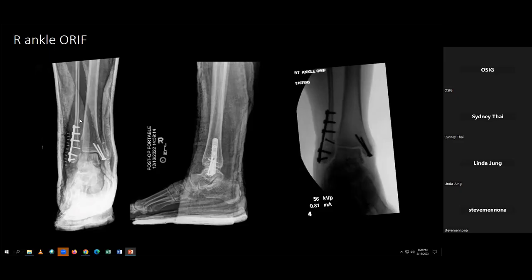So cortical bone, or the bone on the outside, is much denser, whereas bone in the metaphysis is spongier and softer. So they actually designed specific screws that bite into certain types of bone better. To get that distal bone fixation, they make these screws with bigger pitches. And the ones that are proximal also go bicortical, so you're crossing both cortices. That's giving you stronger, more rigid fixation. The one distally, you could go bicortical, but I think a lot of the surgeons here like to go unicortical to avoid going into the joint line. Because if you can imagine a screw going into that joint line, that's going to be really painful.